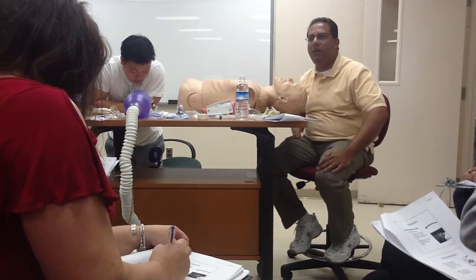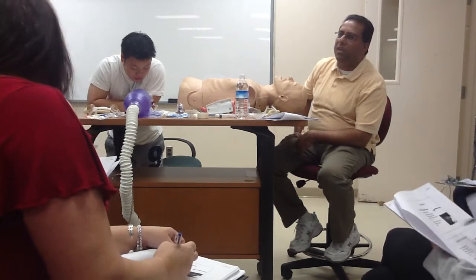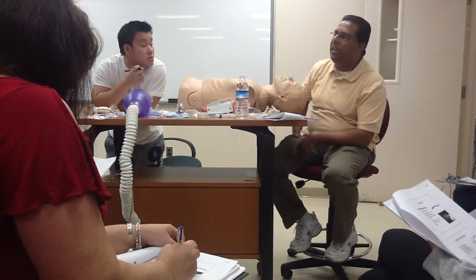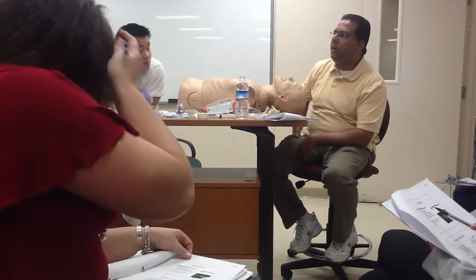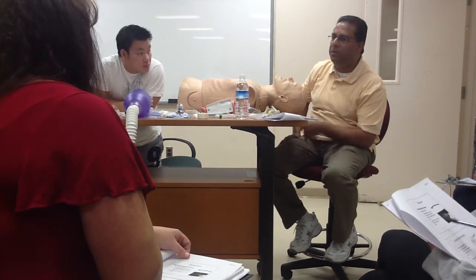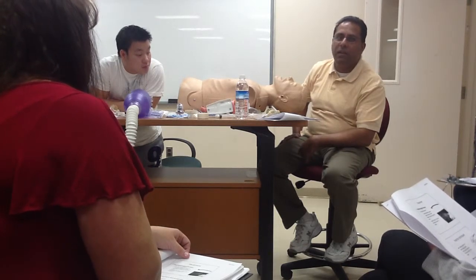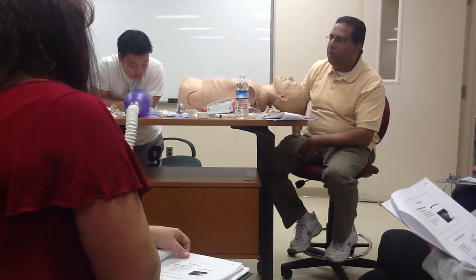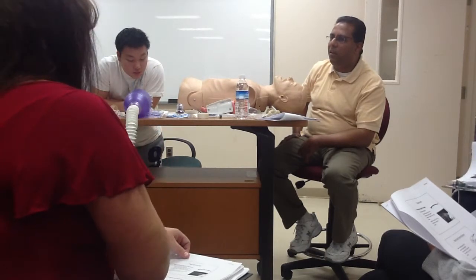Conscious patient or unconscious patient. Well, at the end of the day, if you walk in the patient room to suction this patient, and the catheter was not going down, and the man needed suctioning frequently, every time I go in there and suction him with the catheter, what am I going to do to his nose? I'm going to cause bleeding, right? And so therefore, you put a nasopharyngeal airway in place to protect the nose, is that what you're saying?